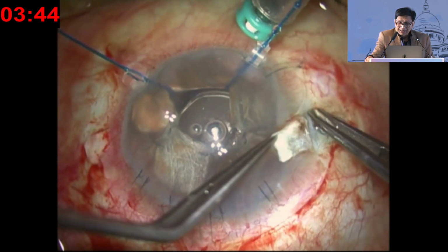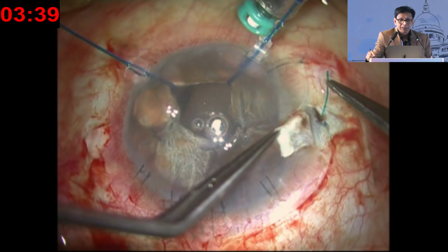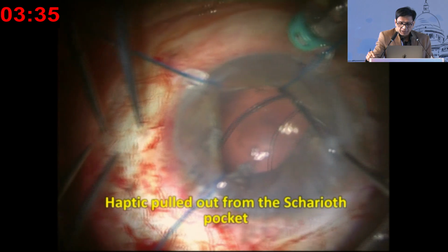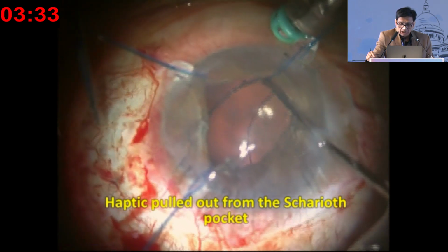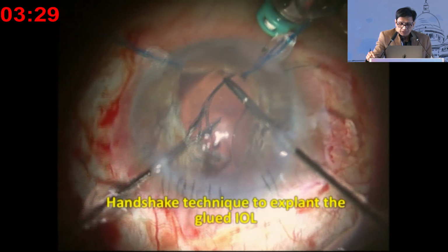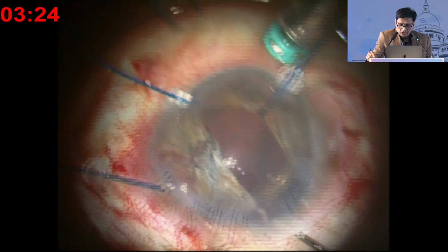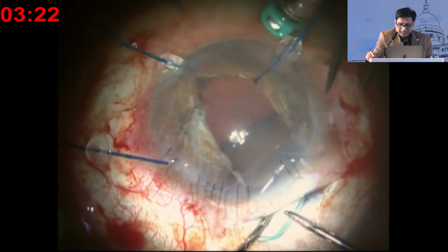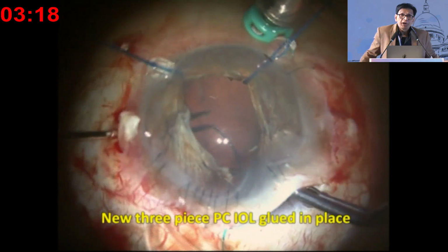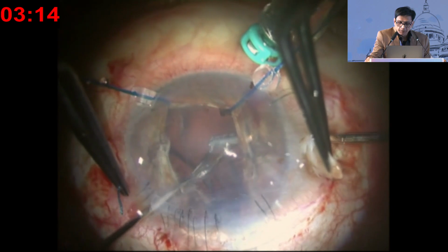Now I have to dislodge the glued IOL. And remember, all of you ladies and gentlemen, there's a PDEC graft inside the eye. Okay? So there's an endothelial graft inside the eye, and my heart is really scared right now. So now I see I'm carefully explanting this IOL. I'm making a scleral incision there, tunnel incision, and I've explanted it. Now I'm going to re-implant a fresh new IOL of the correct power and gluing it inside.